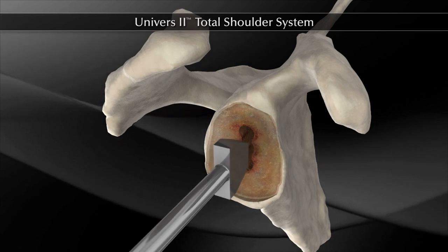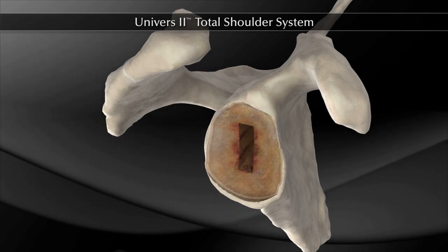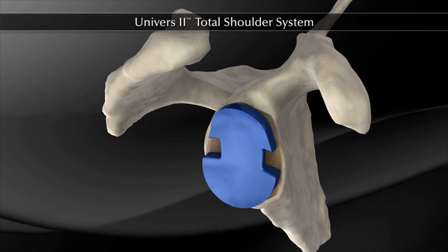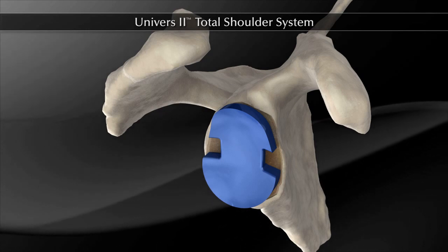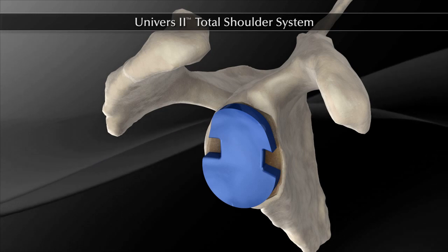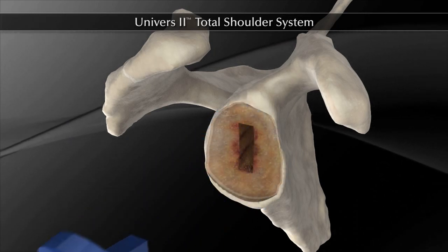A mallet is used to advance the glenoid punch into the roughly prepared slot. The trial glenoid of appropriate size is inserted. Verify that the trial is fully seated against the glenoid surface to ensure proper fit of the actual glenoid implant. The glenoid trial can now be removed with the trial forceps.